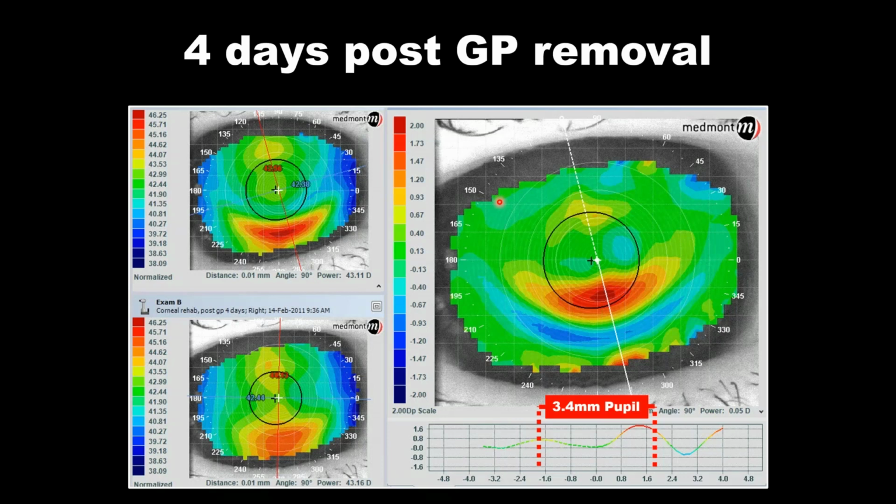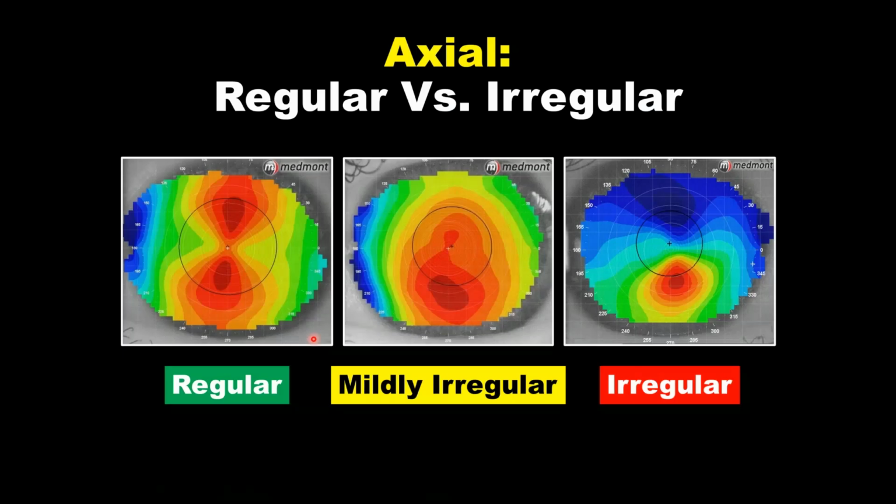Certainly, it's an indication that topographically there aren't any changes. Of course, we should be monitoring the slit lamp signs, the visual signs as well, but topographically, if you're not seeing any colors popping up other than green, that's saying that between the visits, the cornea has not changed.